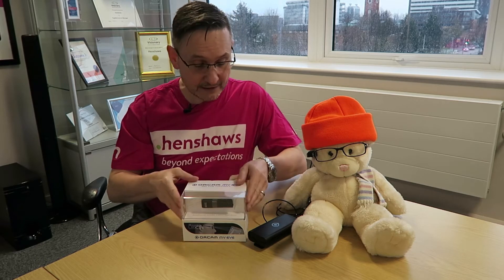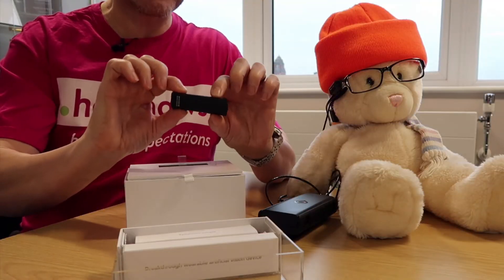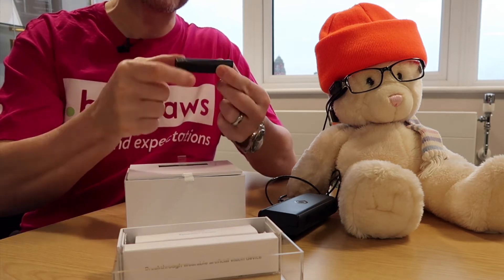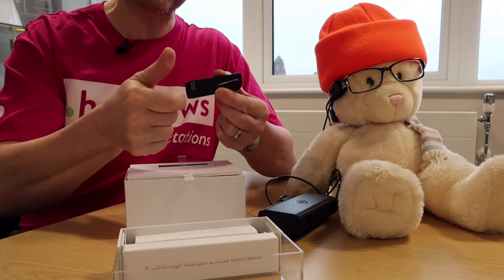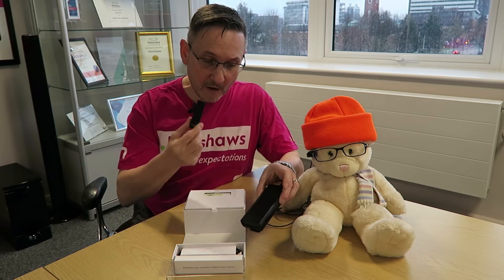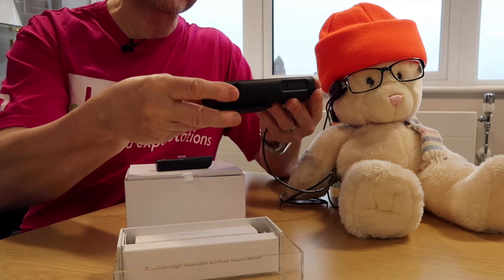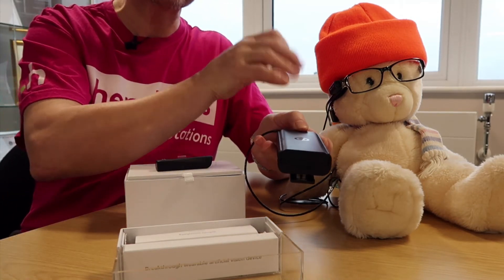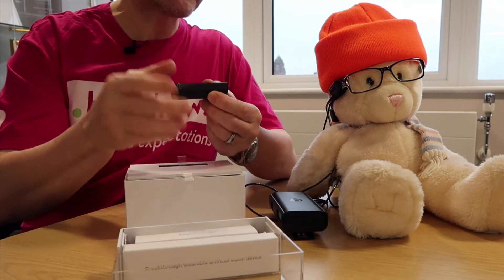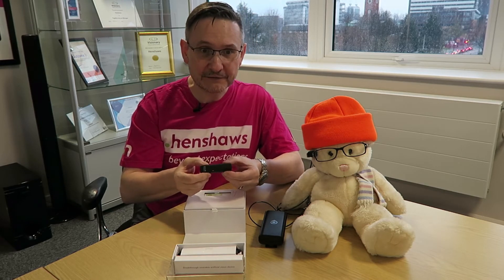This box here contains the very tiny RCAM 2.0. Everything in this unit — which is about the size of a thumb — all the mechanics are inside that. The other RCAM is the size of a pencil case, and then you've got the wire, the camera, the speaker. But everything is inside this one unit. It's the difference between 250 grams and 36 grams.